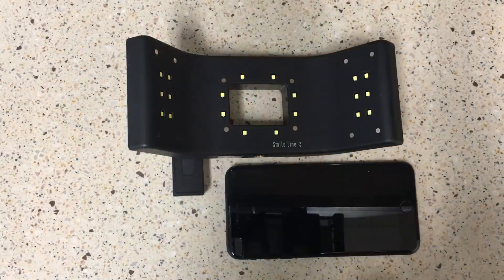Hey, Joshua Austin here with the Dentistry IQ product navigator video pearl. Today we're going to take a look at the SmileLite MDP, which stands for mobile dental photography. This is an item that helps you quickly and easily communicate about shade with your dental lab. Let's go take a look.